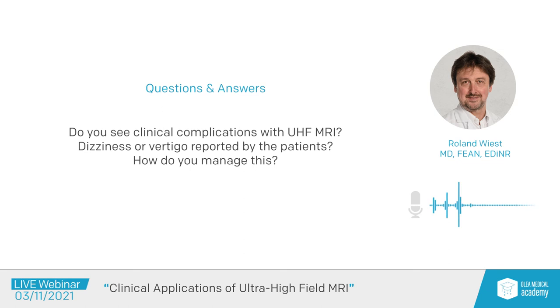All of these patients, of course, had previous MRs at 3 Tesla, so they are familiar with the environment. It's not a patient who sees the 3 Tesla or the 7 Tesla at the very first exam. So we do not have this kind of claustrophobic dropouts anyway. And the vertigo that occurs during entering and leaving the scanner, that's something that is tolerated well. The most, I think, intriguing thing is that patients complain about the muscle twitches. So this is something that is frequently said by the patients, that this is not very nice to tolerate. The electrical stimulation of the nerves, that's the problem.